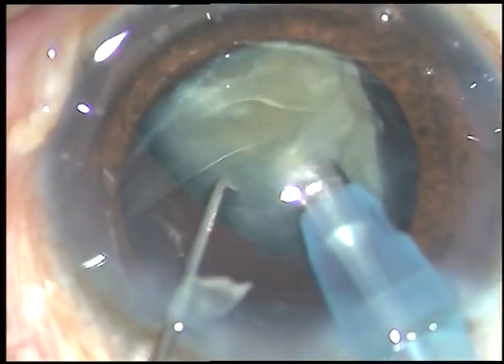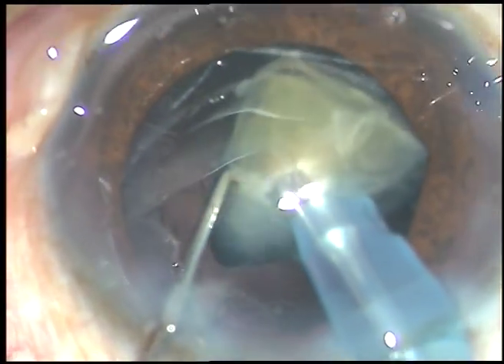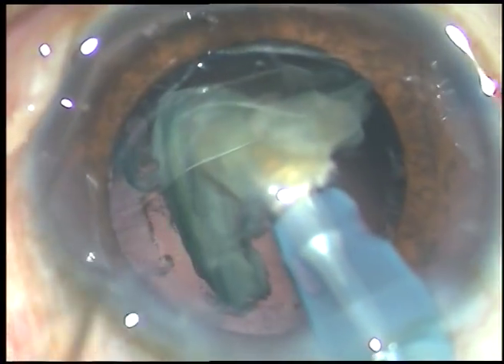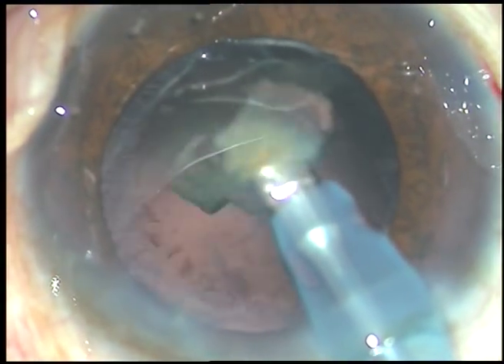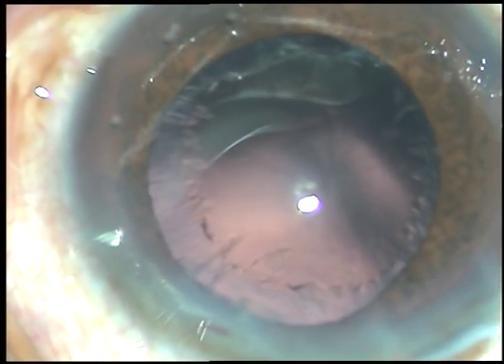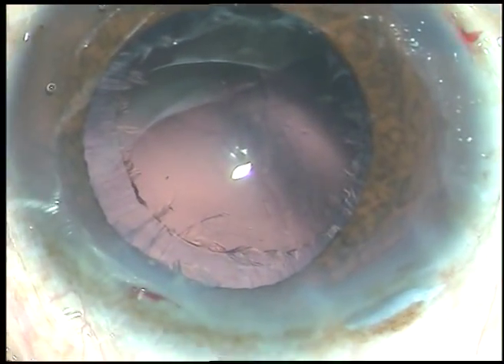The chamber is very stable, there is no surge, no fluctuation of the anterior chamber. During emulsification of the last portion, I remove the chopper so that the anterior chamber becomes more stable. And now a little bit of viscoelastic is again injected.